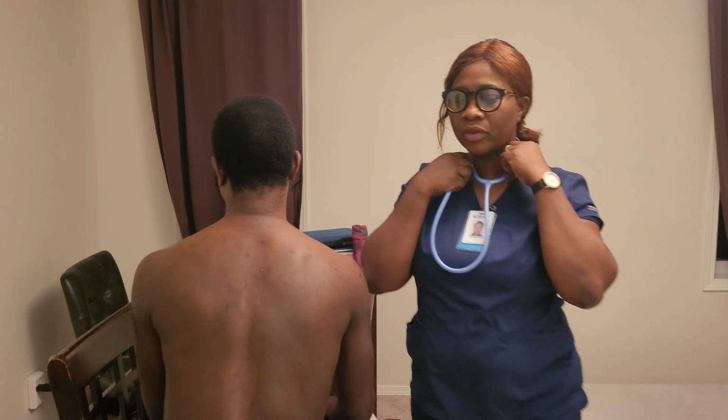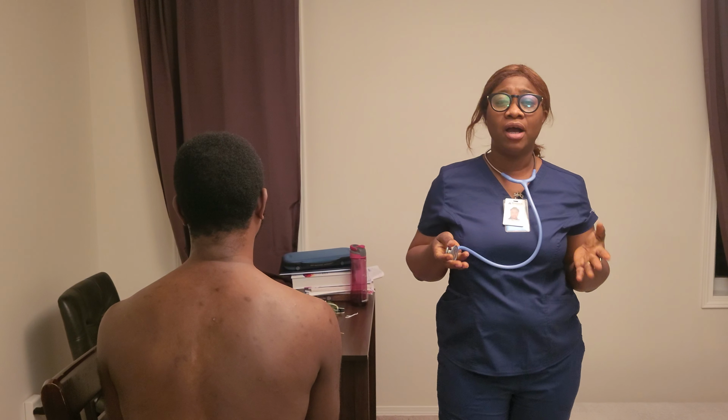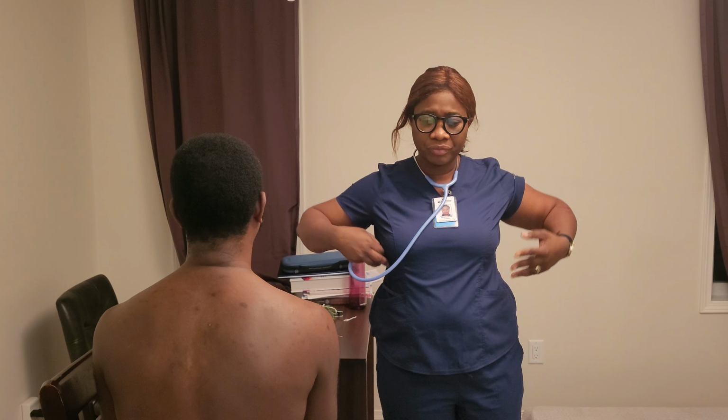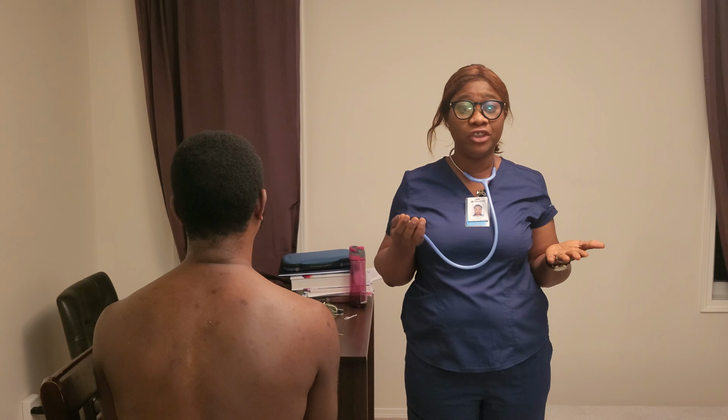Thank you. So for the auscultation of the posterior chest, I'll be evaluating for the presence and quality of normal breath sounds, and what I'm supposed to hear is vesicular sound. I'll auscultate from the apices at C7 down to T10 at the base. Then I want to hear vesicular sound.